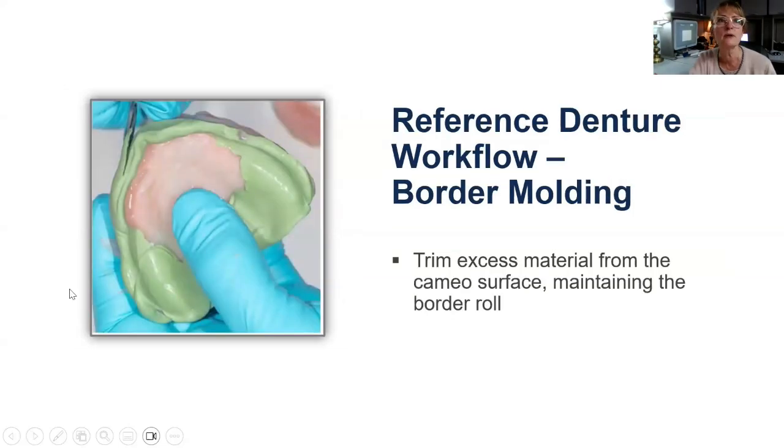And notice we've got the blade, a scalpel, a Bard Parker up here. So you will see some excess material when you do this technique. And I wish I would have had a scalpel with me when I did this workshop, but I did not. And now I'm afraid to try to cut it, that I don't have impression material with me to redo it. But it scans much, much better if that buccal contour is smooth instead of the lump, the overflow of the actual impression material.